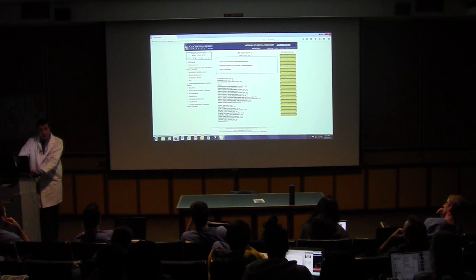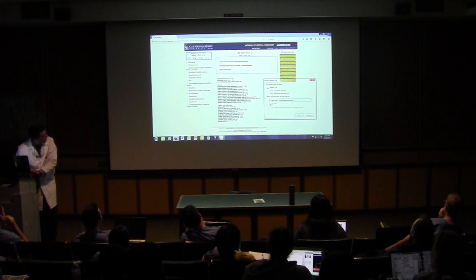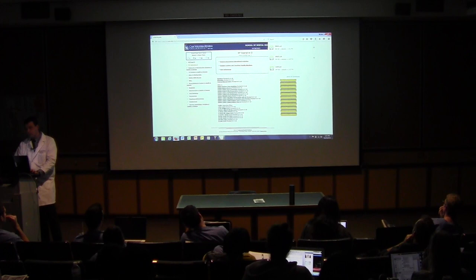So if you have CEREC running on your computer, click here on those files. Let's say they are doing number 30, right? That's project number 11. You're going to save the file. Let's hit OK. Here's the file on your computer. You can save that file on your desktop, which would be the easiest way to work with this file here. Once you have the file on your desktop, it's right here.